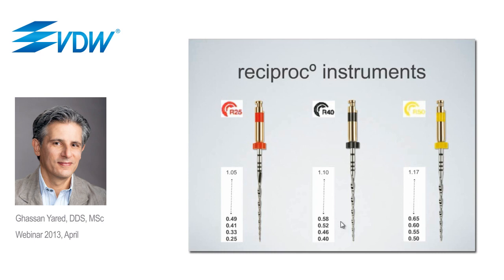Then there is the R40, which has a diameter of 0.4 millimeter at the tip. Then it has a 6% taper over 3 millimeters. Then the taper decreases beyond that point. The R50 has a diameter of 0.5 millimeter at the tip, a 5% taper over 3 millimeters, and then a decreasing taper.